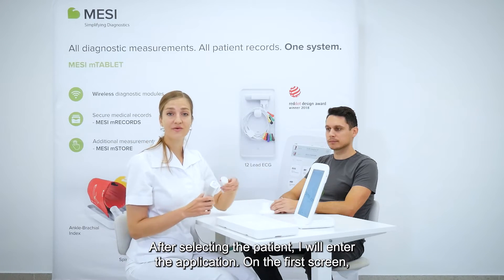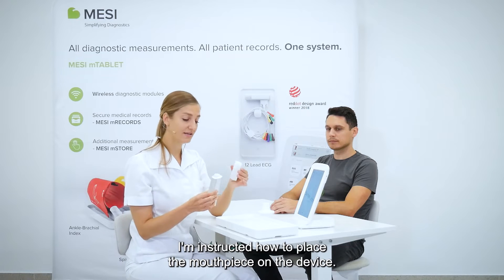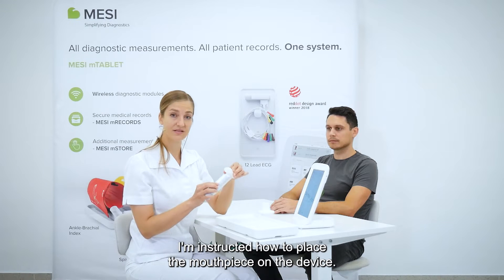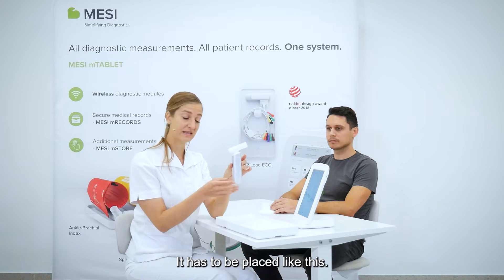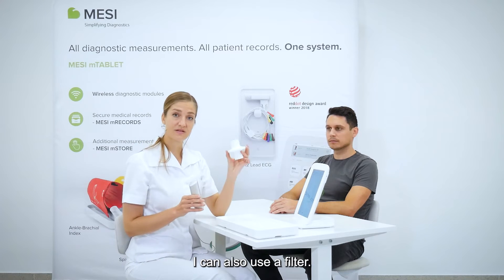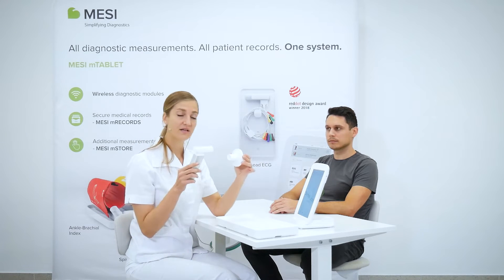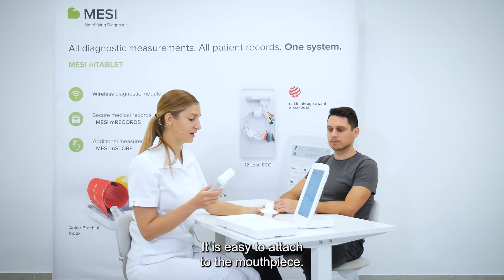On the first screen, I am instructed how to correctly place the mouthpiece on the device — it has to be placed like this. I can also use the filter whenever needed, and it is very easily attached to the mouthpiece.